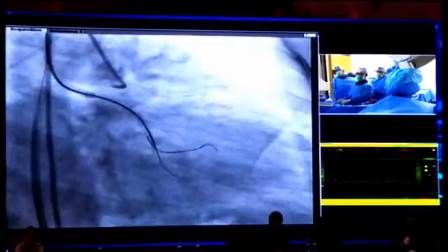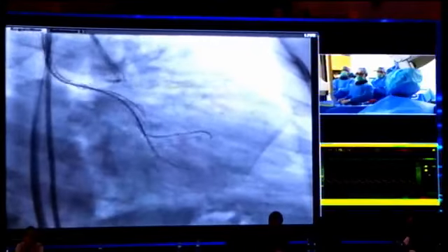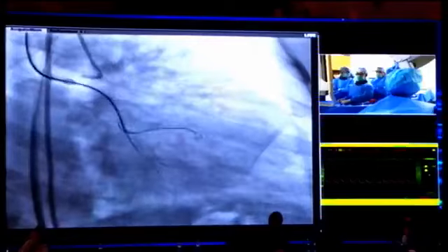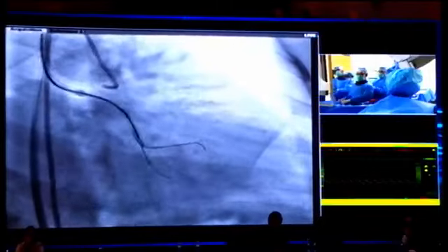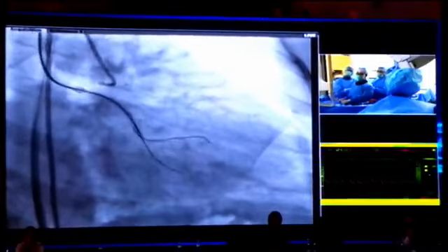And Dr. Matsuo previously said Gaia Next is better as the first guide wire. Is it trying to go into the distal LCX or the real lumen? My choice depends on the situation, because Gaia Next is not available in India yet. So maybe if I'm the operator, I try standard Gaia.